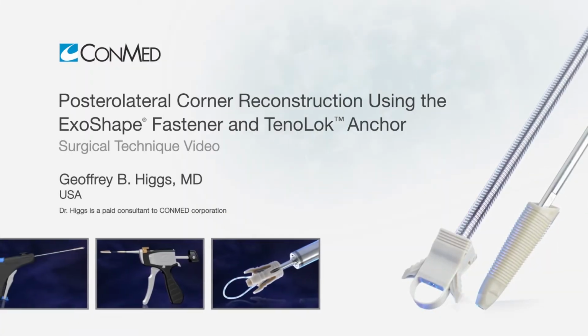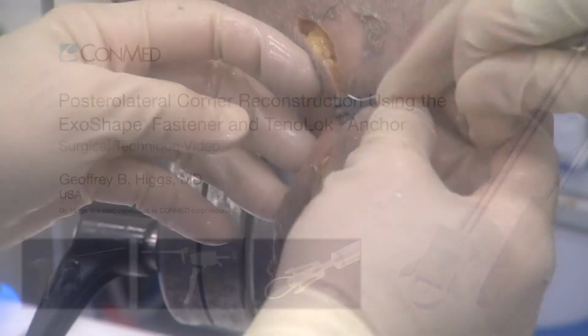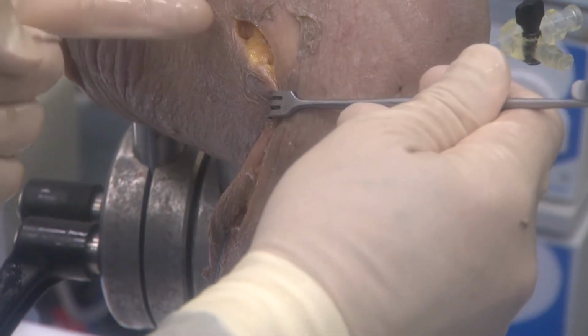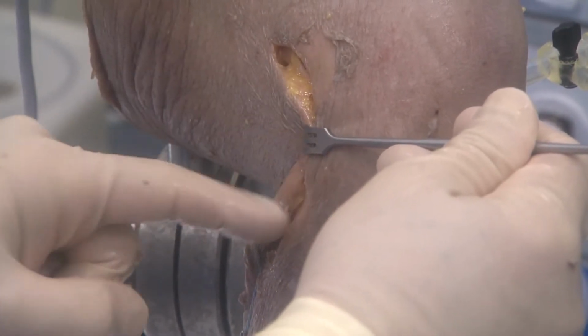We're going to demonstrate a posterolateral corner reconstruction using the Med exoshape system. We can achieve aperture fixation at all locations. On the knee, we make a curvy linear incision that allows us to get access to the epicondyle here as well as the fibula here.